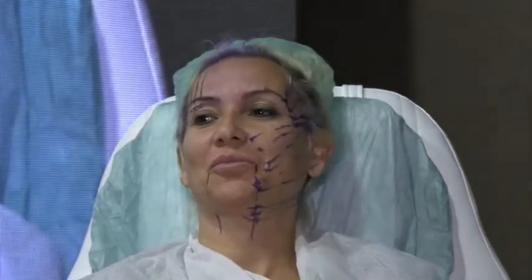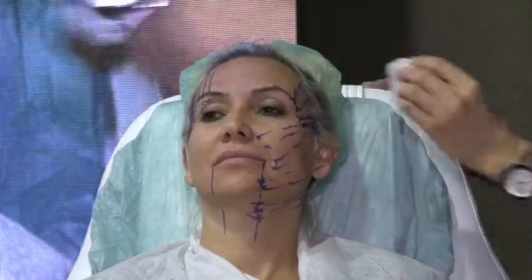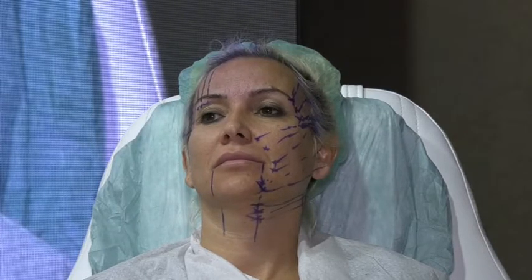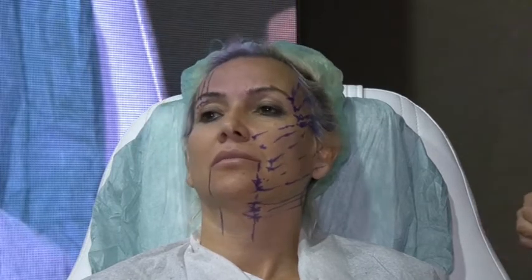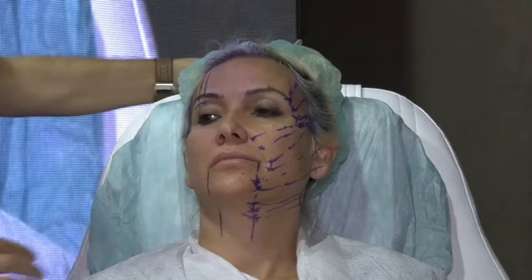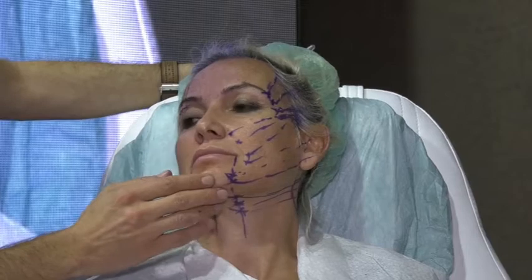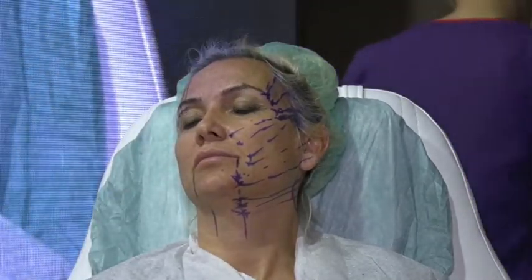Doctor is asking when your patient does filler, how many days after can we do the threads? Few days. If the patient has no edema, no swelling, no pain, you start working immediately. No, never do it together, because you never know the shape, what will happen after. You have anesthesia, you have edema, you have trauma. So sometimes you have today's shape, after 1 week you have a completely different shape. So you cannot do it the same day at all.